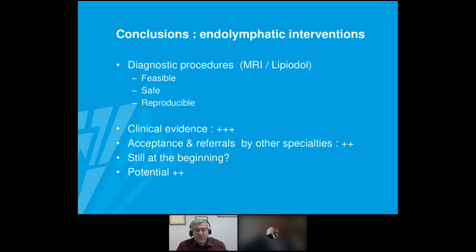When you do it under X-ray, then you have to use Lipiodol. These techniques are feasible, they are very safe, and they're also reproducible. And I think that today there is more and more clinical evidence to perform these procedures in daily life, not only from a diagnostic perspective, but also from a therapeutic perspective.